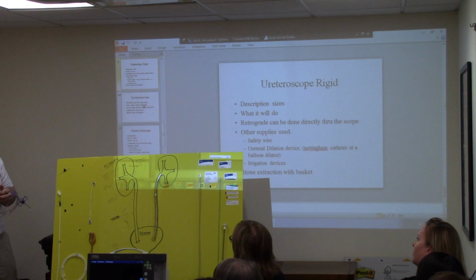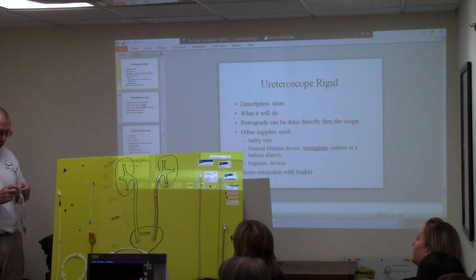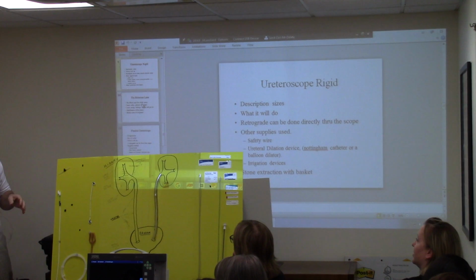Up north, we don't do it. Well, maybe it's west, I'm thinking. West uses this. I think Dr. Leyland likes this. And in New Mexico, they use the Pathfinder. So they like to do it manually. Like I say, up north, we just hook up a pressure bag and it's just constant pressure. They just regulate it with a little valve. So no extra supplies with that? No.